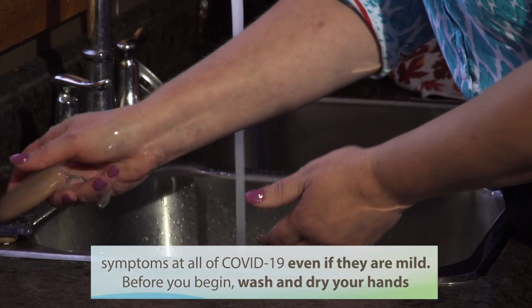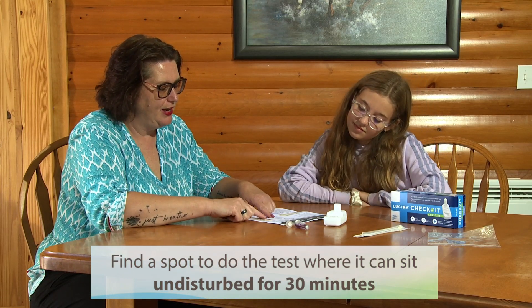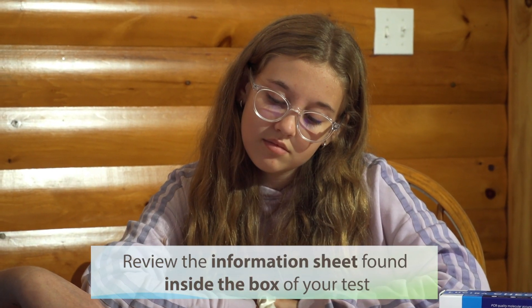Before you begin, wash and dry your hands. Find a spot to do the test where it can sit undisturbed for 30 minutes. You can review the information sheet found inside the box of your test.